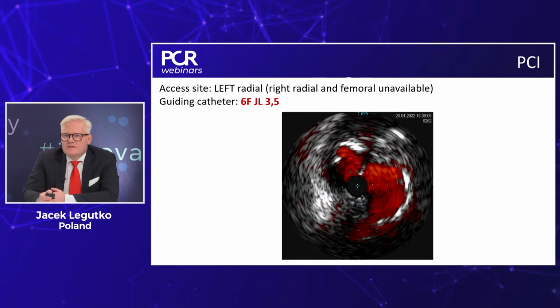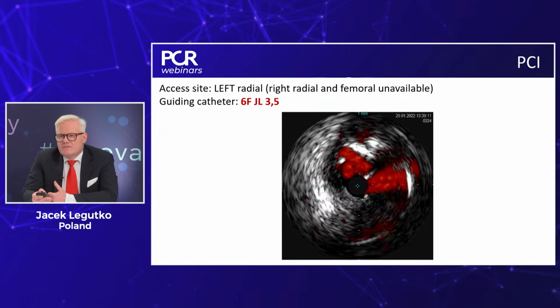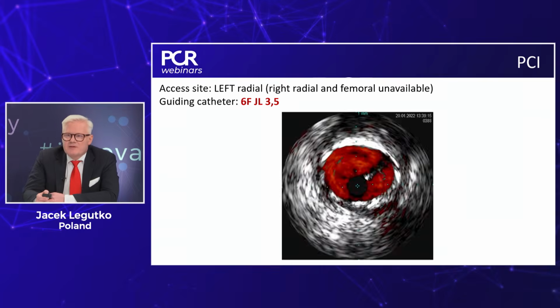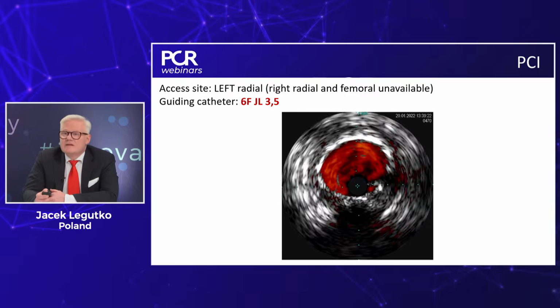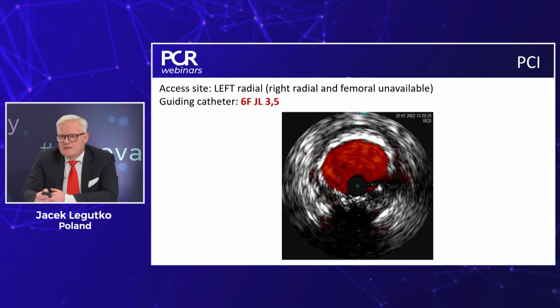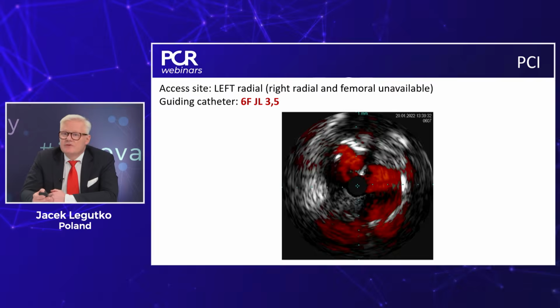And now you see what happened in this patient. You see some maybe neointimal proliferation. On top of that, for sure, some thrombosis. Maybe there is stent rupture. It is not clear from this picture. However, there is a stenosis in the ostium, and this stenosis caused the event. However, with this IVUS pullback, I also proved that now my wire is going through the lumen of the stent and not through the stent struts.